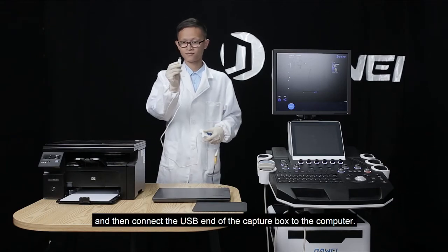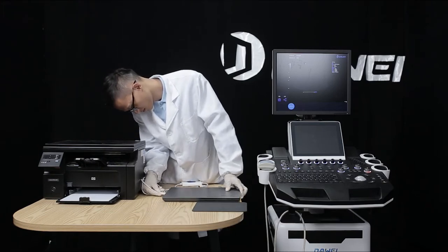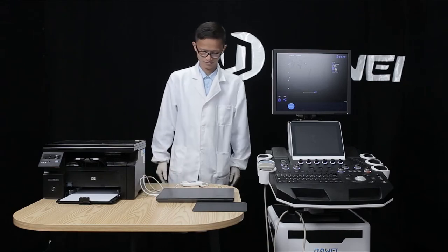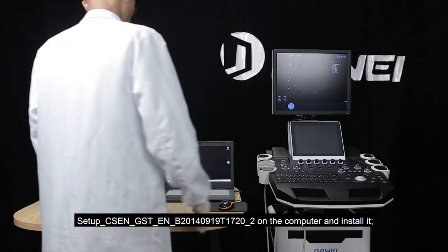Then connect the USB end of the capture box to the computer. Open the workstation software on the computer and install it.